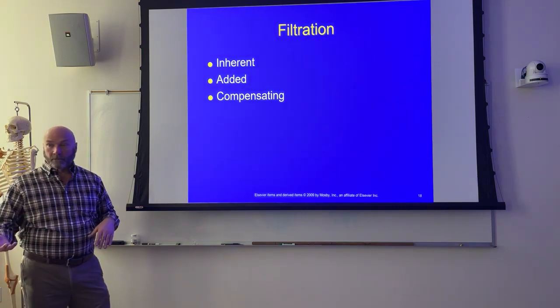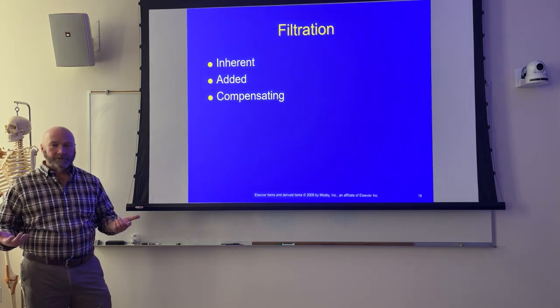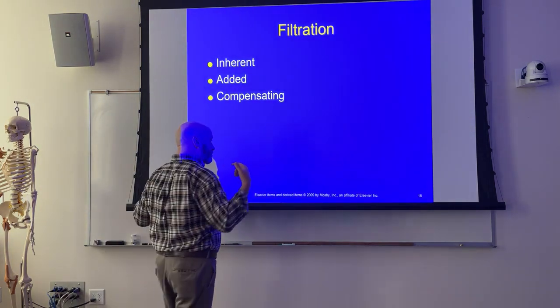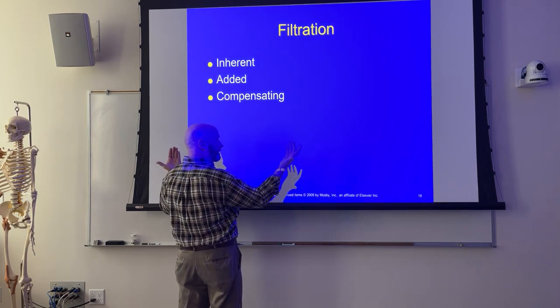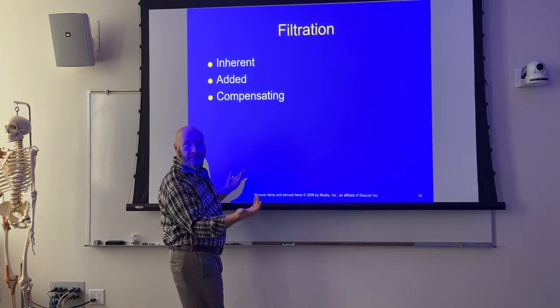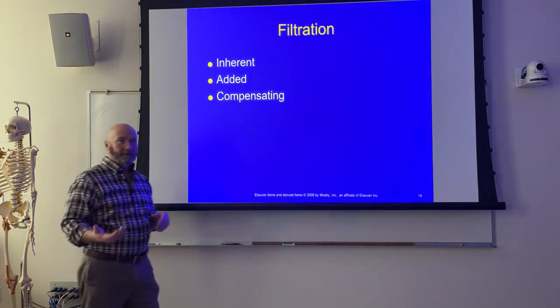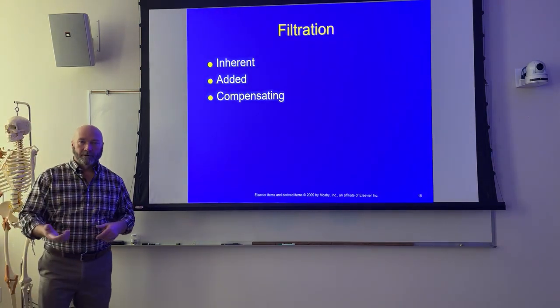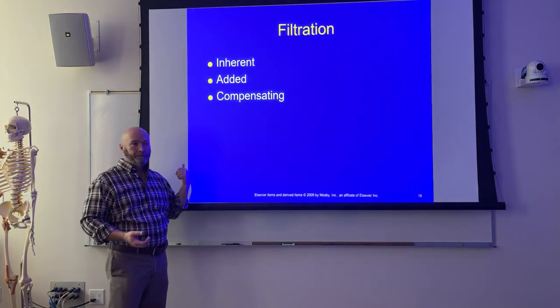And it's usually on young women, so we've got developing breast tissue, and we want to limit the dose to that. So most of the time on your scoliosis series, we'll shoot PA, and the body becomes a filter, but we're also using that trough filter to try to increase the effects of collimation, essentially, right? So collimators do so much, but if we add something to it, then it'll help to absorb what the collimators might not absorb and further reduce the breast tissue dose. So that may be the only place that in your career you might actually see compensating filters.